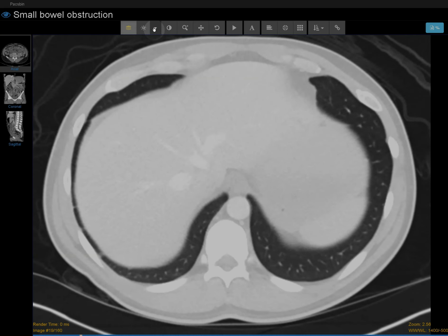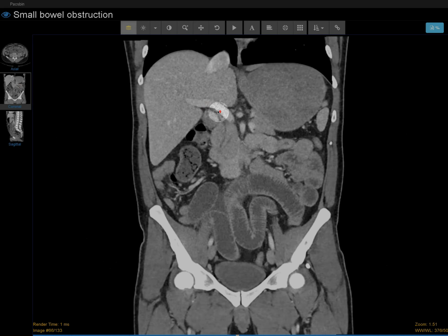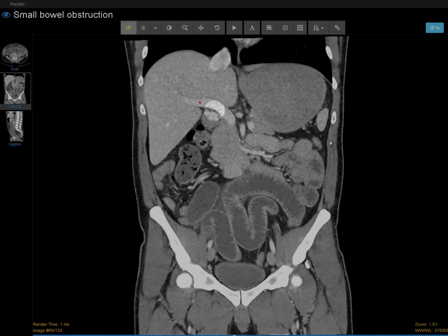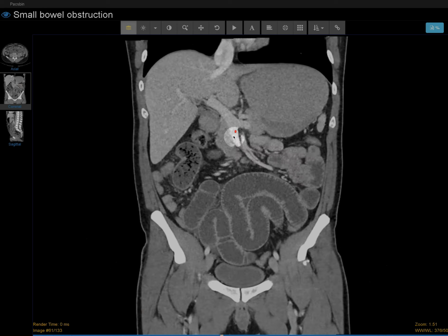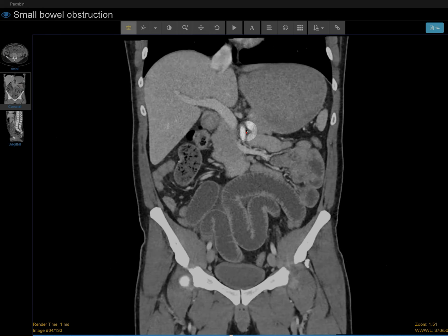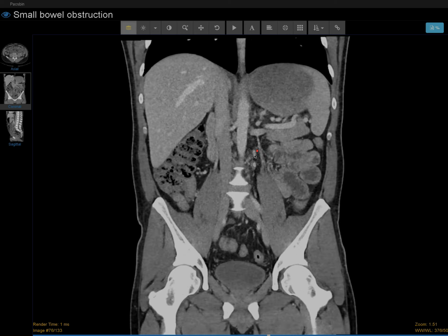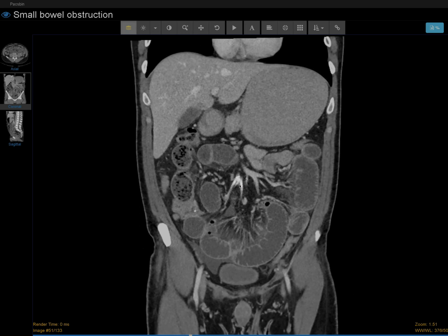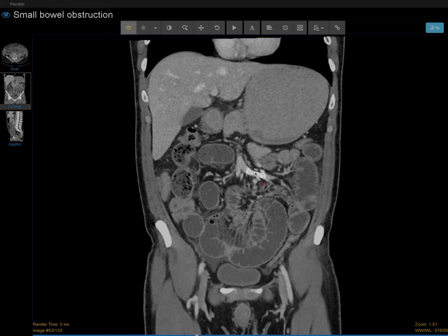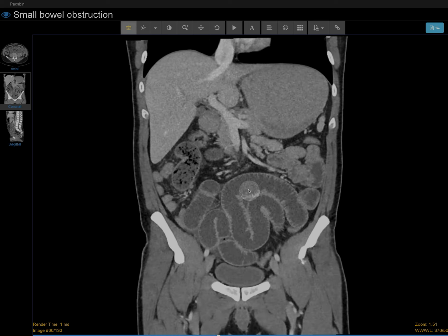So that's okay. And anytime there's inflammation going on, I like to make sure that the vessels are patent. Again, our portal vein, left portal vein, right portal vein, main portal vein, splenic vein, superior mesenteric vein, or sorry, inferior mesenteric vein. There's the inferior mesenteric vein coming off of the splenic vein. And I would follow them a little bit more distally to make sure that they're okay. So the branches of the superior mesenteric vein are widely patent. So at this point, I'll just follow.